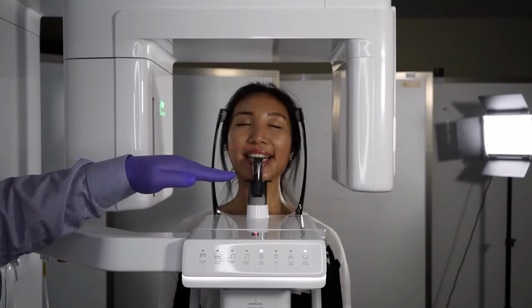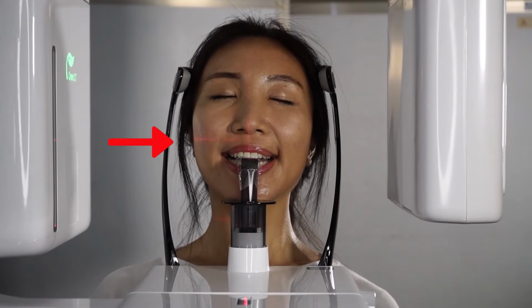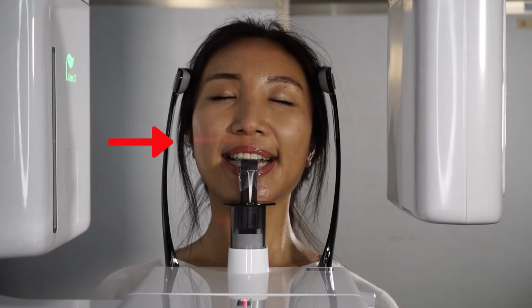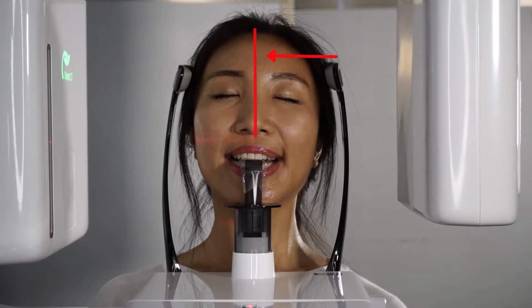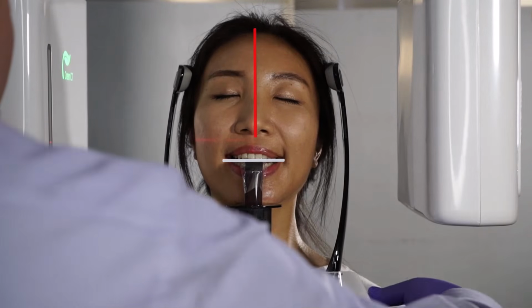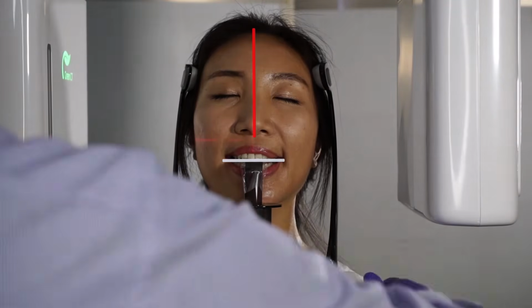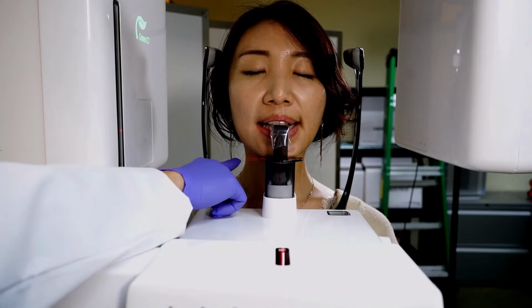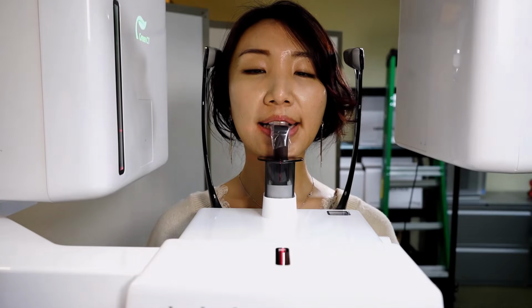Please note, the laser light that you will see displayed on the left side of the patient's face is strictly a reference point of the center of the field of view of the given scan size that you are acquiring. Once we have our mid-sagittal light adjusted, along with our patient's maxillary arch parallel to the floor, we can then adjust our temporal rod position on the right side of the machine to secure patient. Note, the green X has a new horizontal laser beam to proactively identify and ensure clearance for the patient's shoulders. If the beam is projecting onto the patient's shoulders, the operator will need to make patient adjustments to allow clearance for the bottom of the rotator.